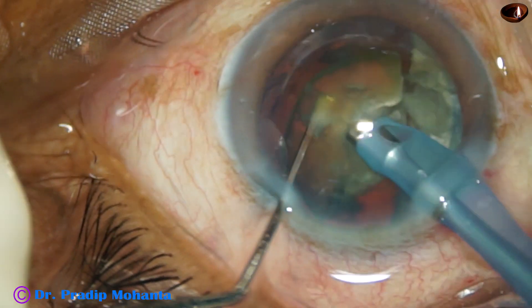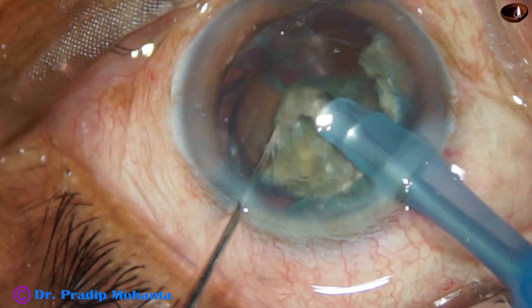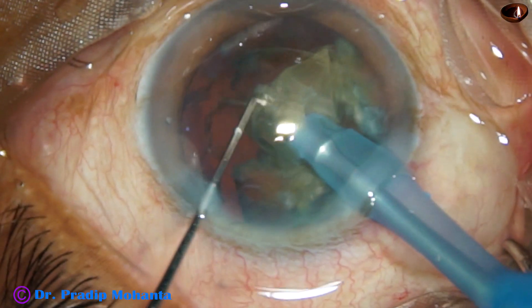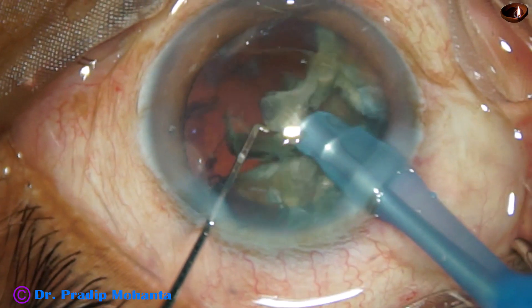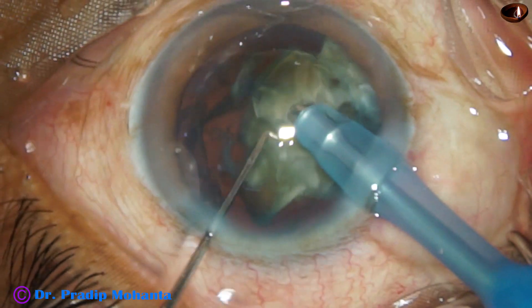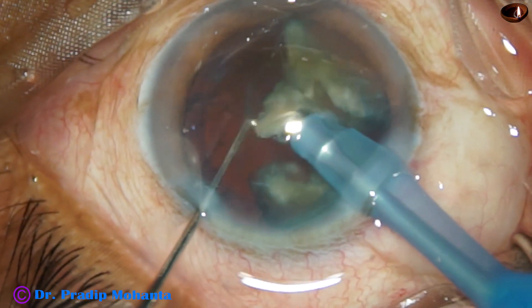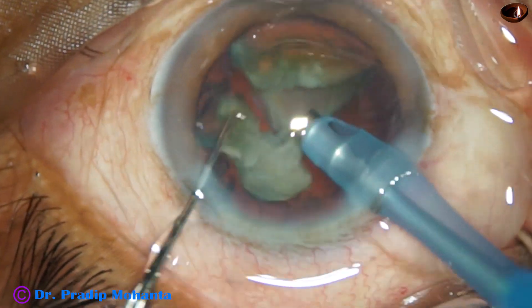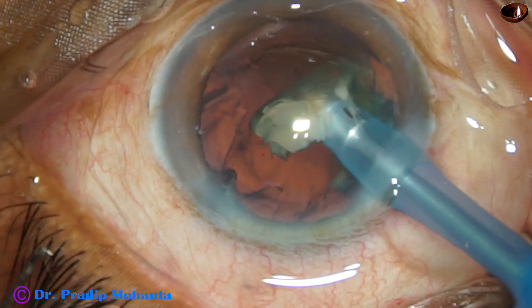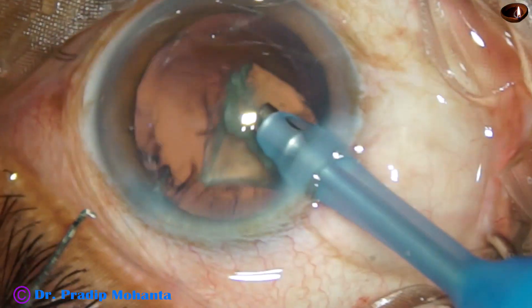Each fragment is being emulsified with ultrasonic energy, which is 70% in this case. Delivery is in continuous mode. The flow rate is 45 ml per minute. Vacuum is 450 mmHg. Bottle height is about 130 centimeters.